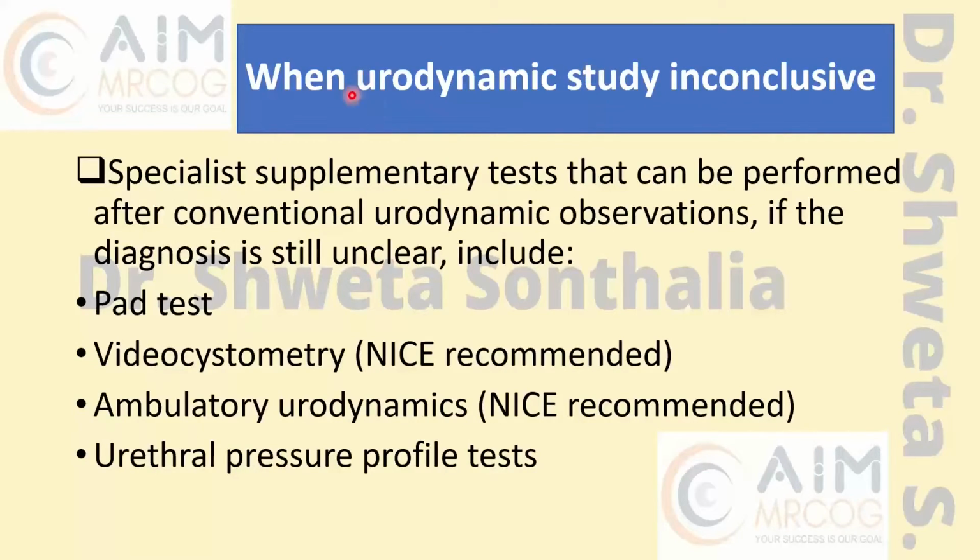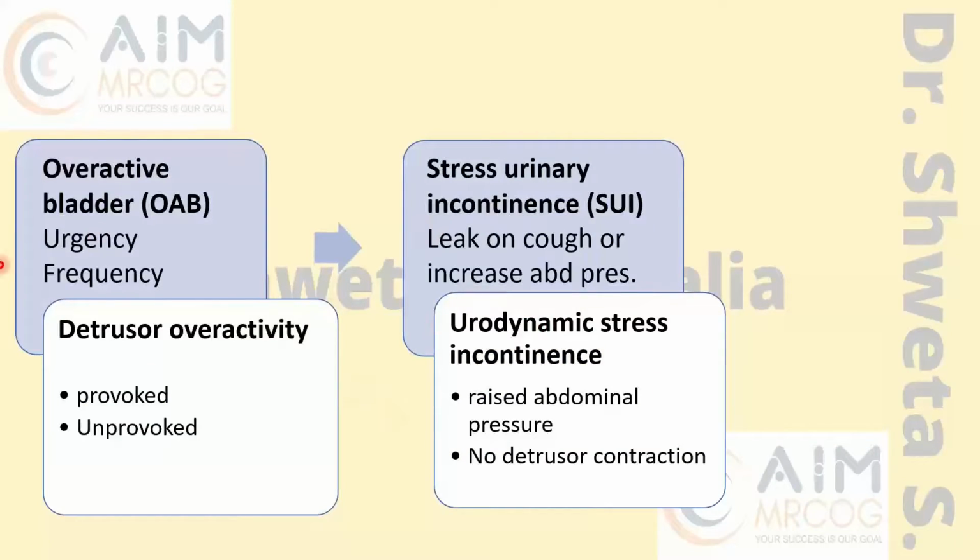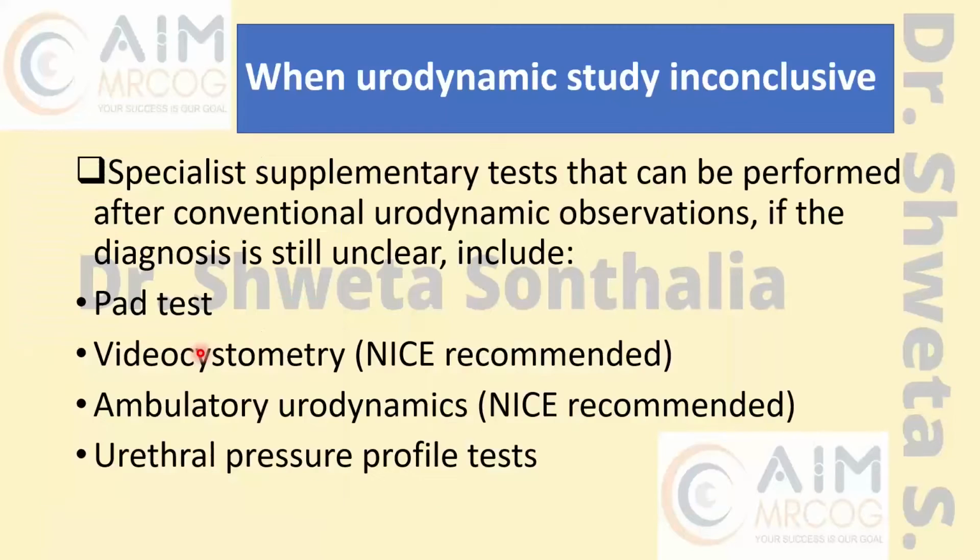Now, whenever your urodynamic study is not giving you any conclusion, what is your diagnosis? You didn't get anything, you have no answers, what will you do? So these are your further tests, which NICE recommend: only video cystometry and ambulatory urodynamics. So in the exam, you will choose one of these.